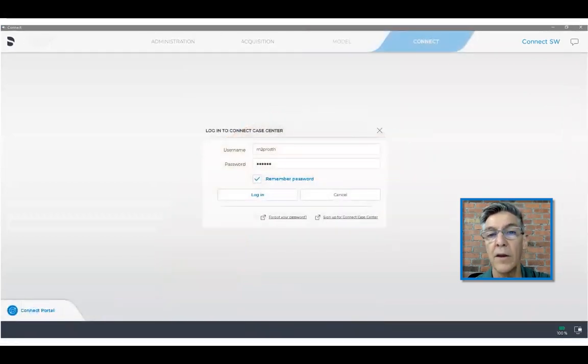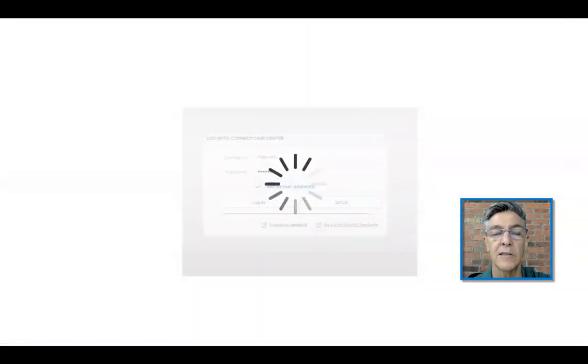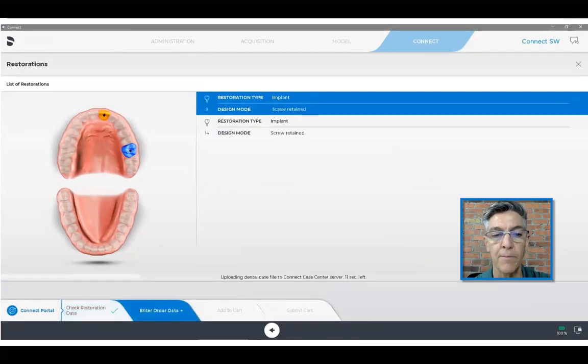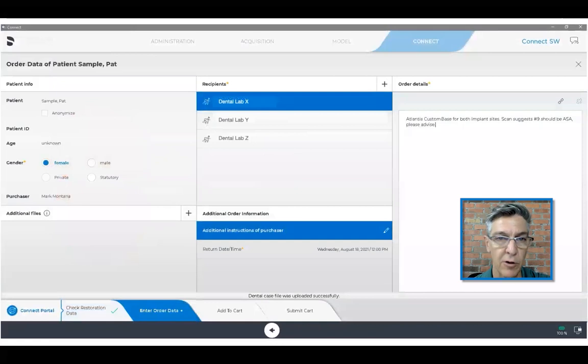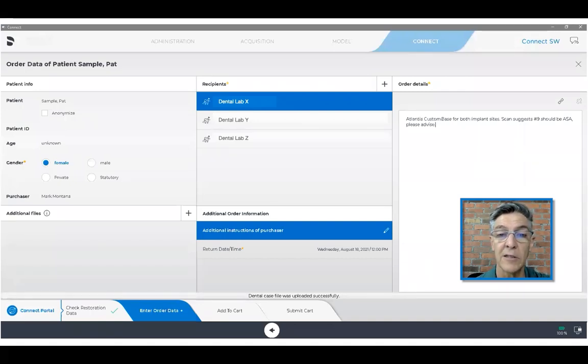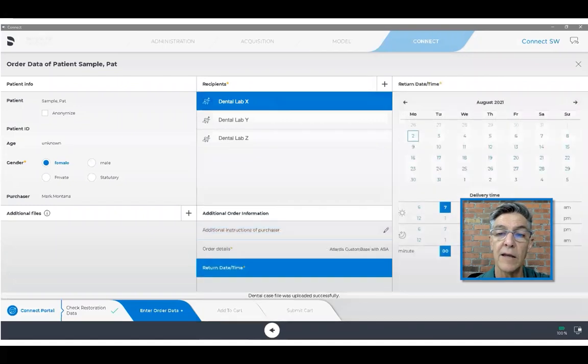Once this is done, I'm going to log into the case center and place some details for the laboratory for how I order this. The data includes the gender of the patient and obviously who we want to send it to — in this case, I've created a dental laboratory X. We're going to enter instructions to the laboratory. I've chosen Atlantis custom base with possible angulated screw access, and we put a date on where we want to get it back.